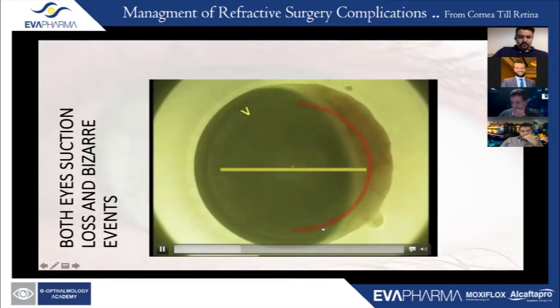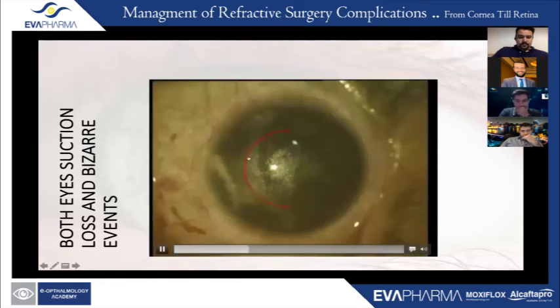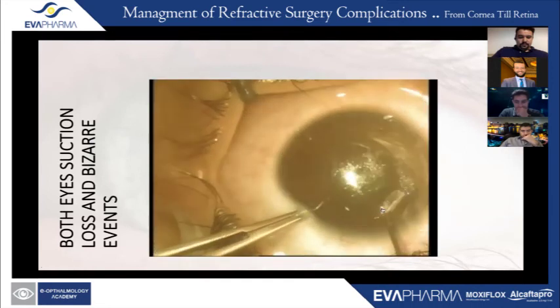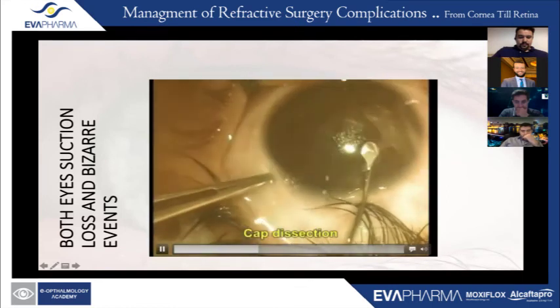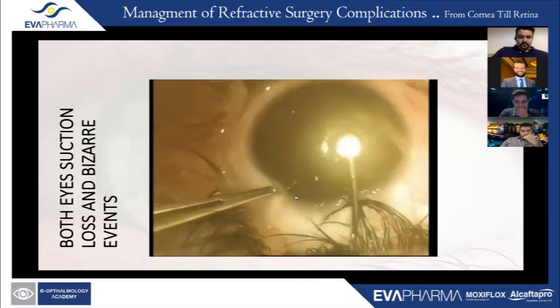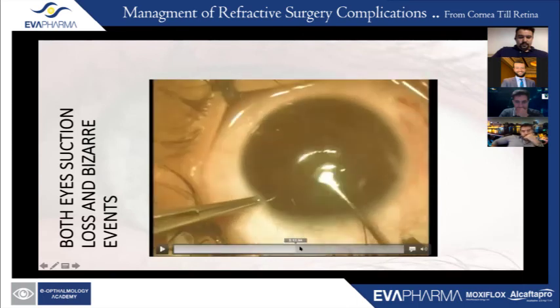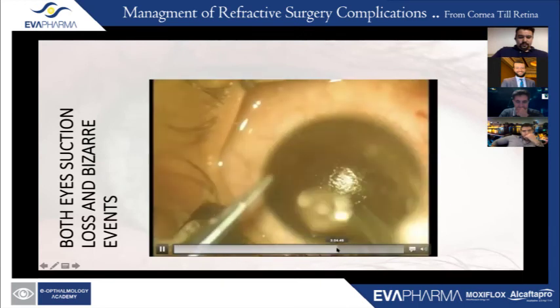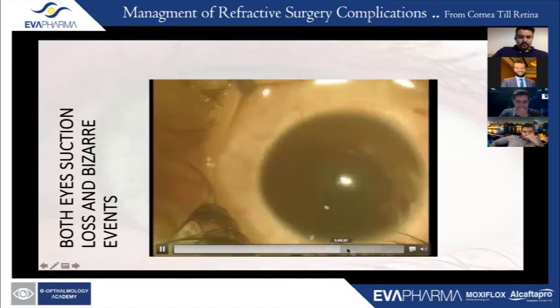So you've got a complete dissection on both sides of the lenticule in this much area, but one part of the lenticule is not dissected, and the anterior surface. So that's basically the part that was not dissected when the patient is seen upright. Again, in the lying down position, you have towards the right hand side the undissected part. So here we judged that the optic zone was fine enough to not cause severe visual symptoms, and dissection was continued. And basically, the lenticule was extracted, and we had about, on measuring, a 5.5 millimeter lenticule.